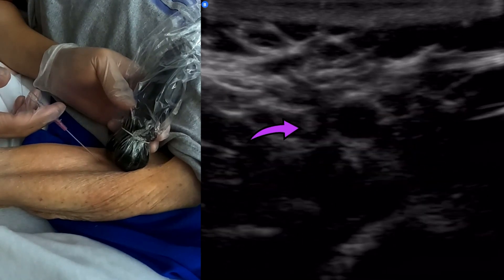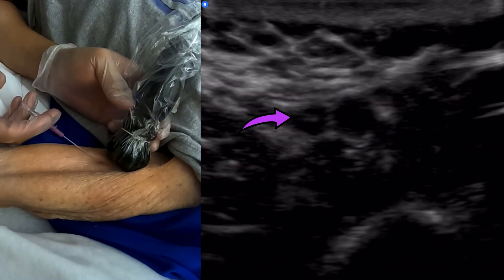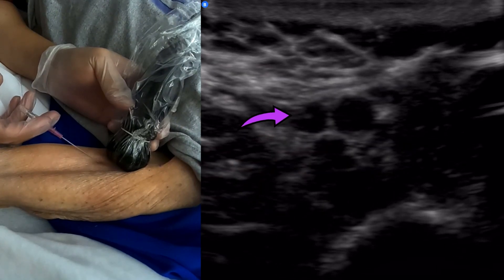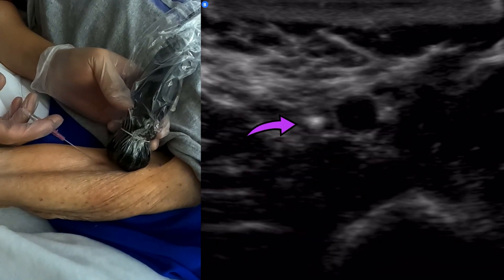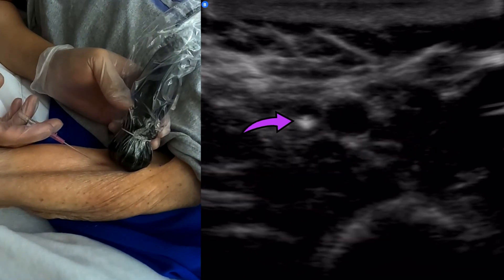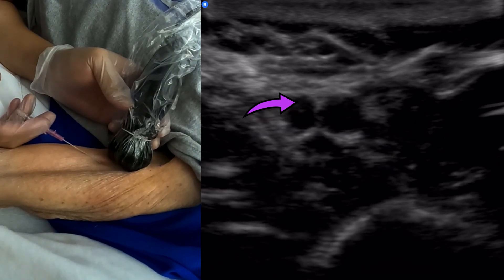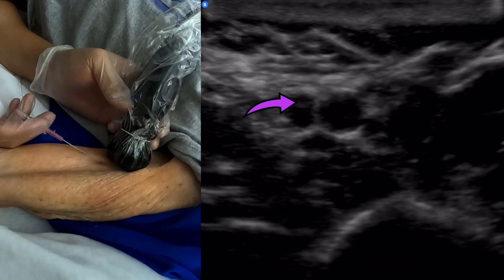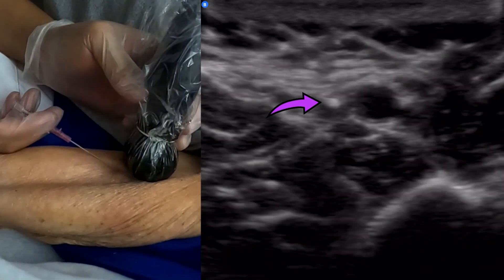Right there. Now I'm right about there — look how much more angle my probe is. Now we're going to enter here — right there. I'm going to zero out, basically center up the needle, and then I'm going to advance so that it stays centered. Almost punctured the artery there, so I'm trying to be careful. Some of you are asking how to keep the left hand probe steady — look at my points of contact: the back of my fingers, my forearm, my hip.